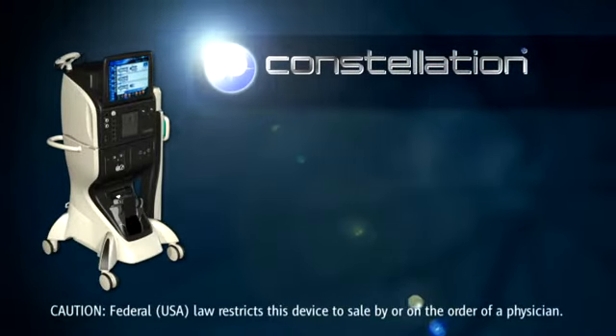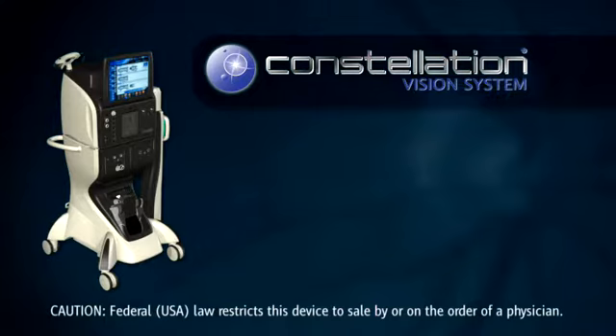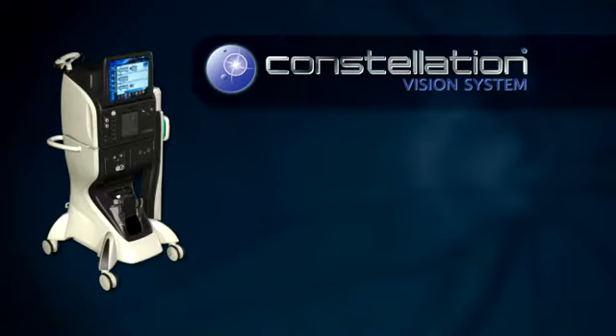In this video, we demonstrate the laser setup. Laser power is delivered in the operating room from the Constellation system by way of two different delivery devices: either an endoprobe or laser indirect ophthalmoscope, LIO, may be used.